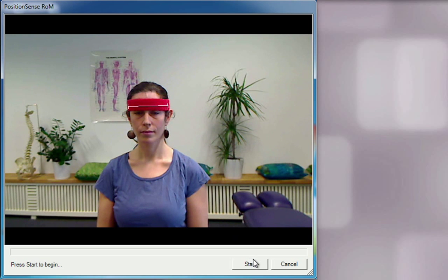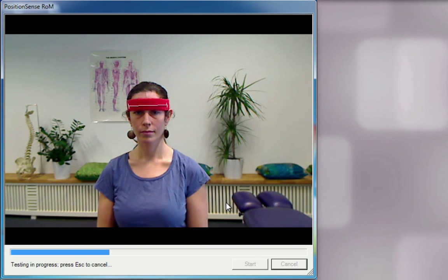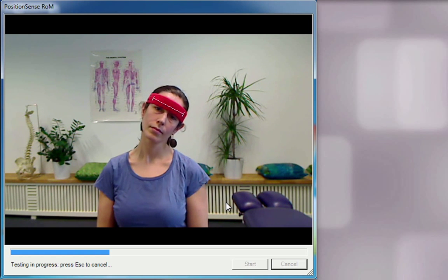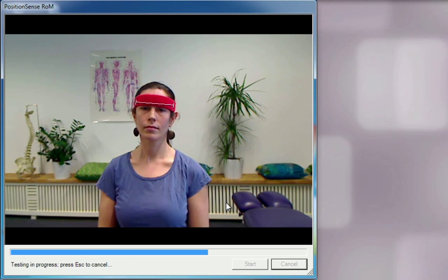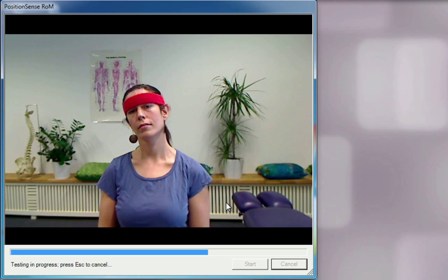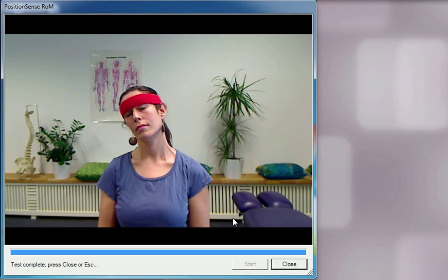To perform the Cervical Range of Motion test, click on New Measurement, then click Start. Follow the verbal instructions. Look straight ahead — click the left mouse button between movements and calibrations. Left ear to left shoulder — click the left mouse button. Right ear to right shoulder — click the left mouse button again. Your test is completed.